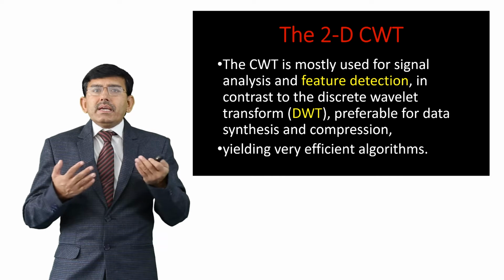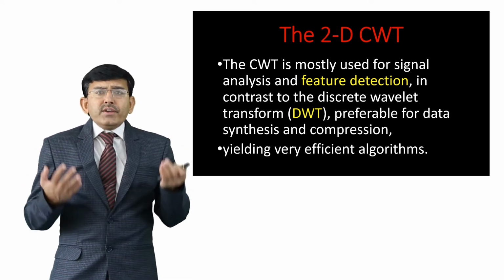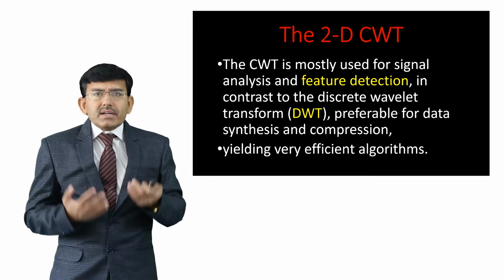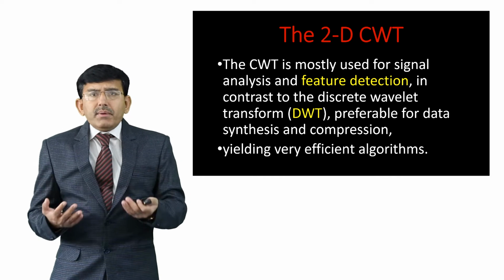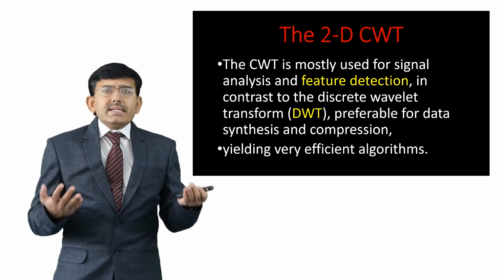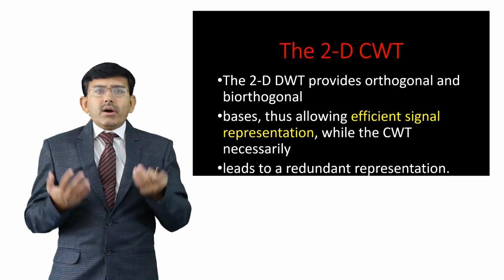The CWT is mostly used for signal analysis and feature detection, in contrast to the discrete wavelet transform, preferably used for data synthesis and compression, yielding very efficient algorithms.